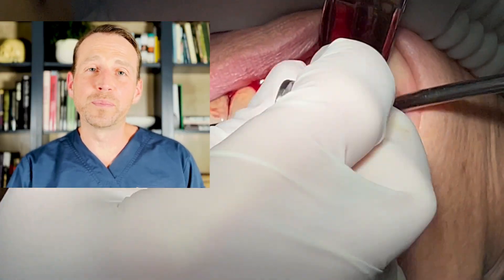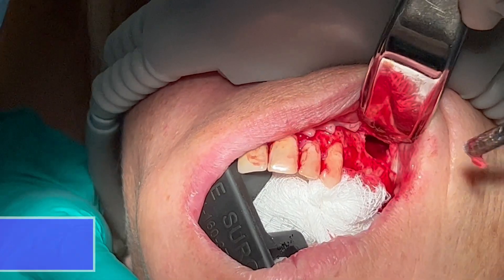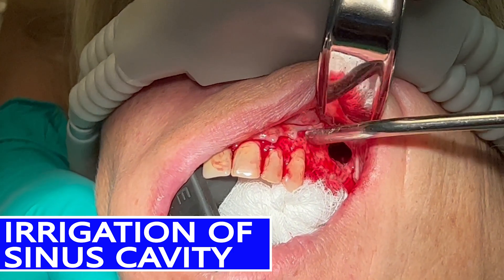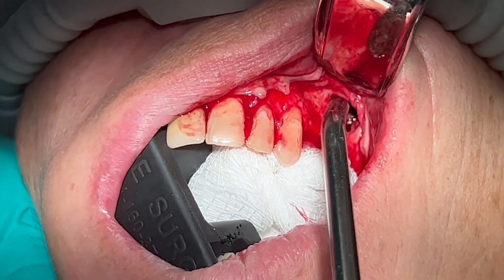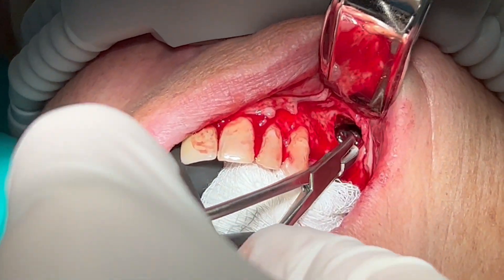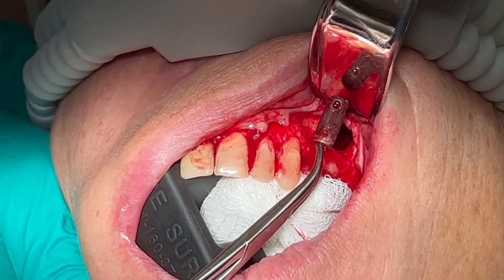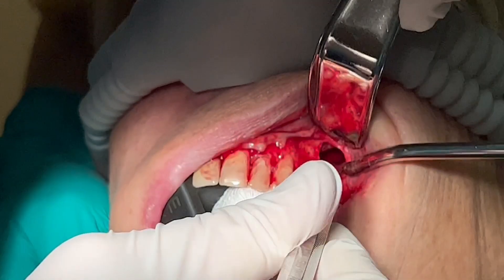I remove all inflammatory tissue while trying to preserve as much of the membrane as possible. After I've expressed as much purulence as possible, I irrigate it thoroughly and try to visualize the implant. I can now see it and I'm going to use a hemostat to retrieve it. Here it is. Feels good to get that out of there.